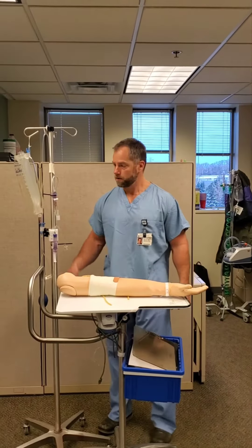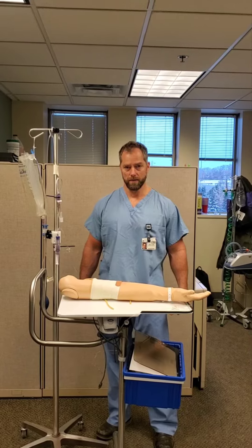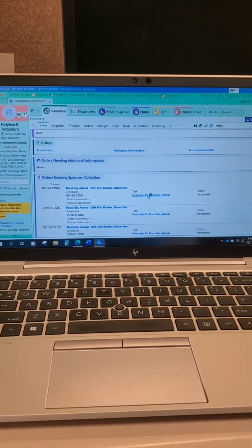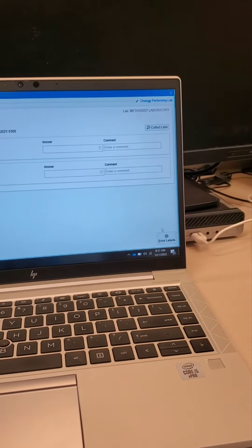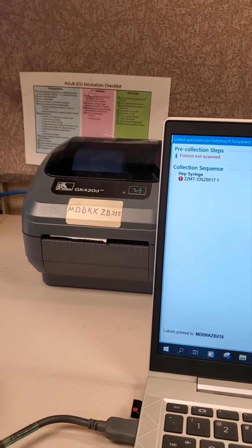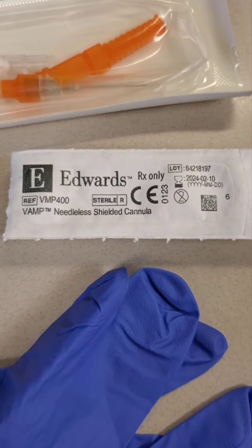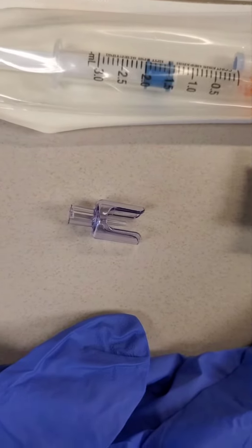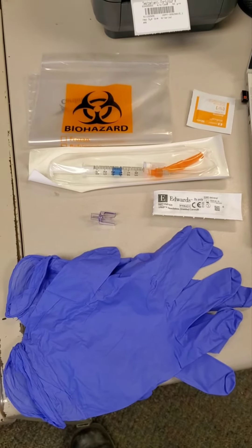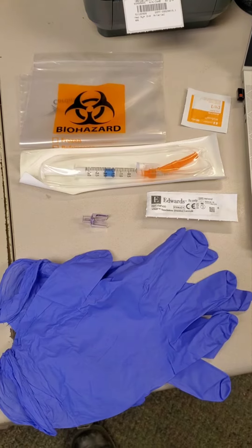This is a quick demo for using the VAMP closed blood sampling system to draw an ABG. Start off by printing your label in EPIC. You will need a VAMP needleless shielded cannula, a biohazard bag, an alcohol wipe, an ABG syringe, and gloves.